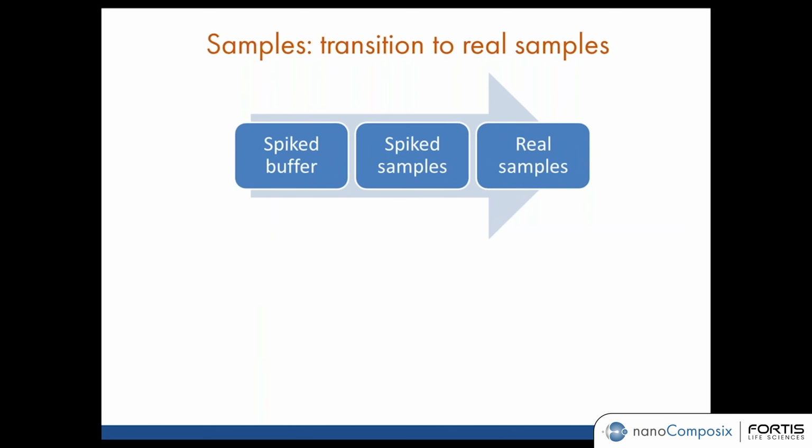So how do you know what type of sample to start testing? Once again, it depends on the type of assay you're building and what reagents are available for use. If you're able to obtain purified antigen, this flowchart might be the type of system you would use. For initial development, you can spike purified antigen into buffer to give you an idea of the performance of your antibodies. This can tell you if you're in the right range and if your antibodies are functional.